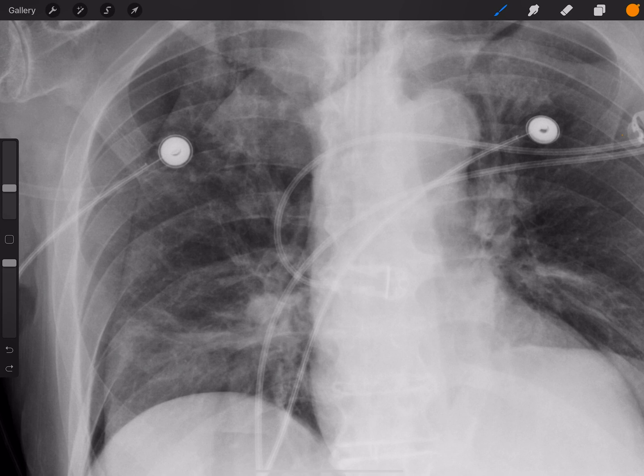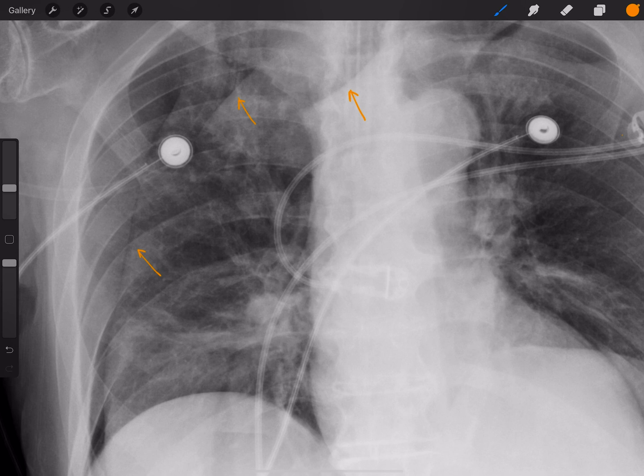The first reason is that this line is actually mimicked two other times on the image. It doesn't make sense for those second and third lines to be a pneumothorax because one is positioned over the mediastinum. So that's reason number one.